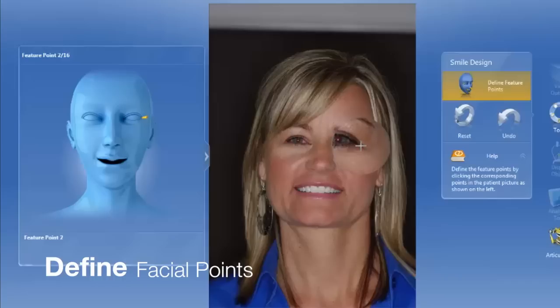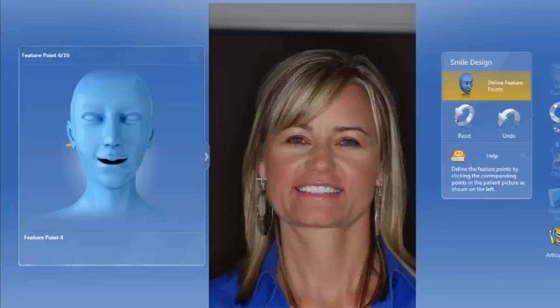We transfer that information over to CEREC by placing some key indicator points along the face. This allows us to have a three-dimensional face and also the teeth cut out so we can put in her digital teeth.